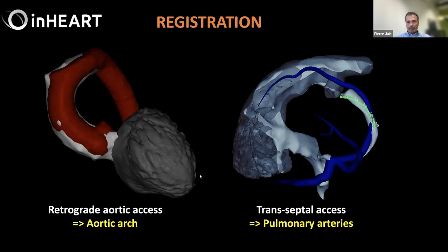If you go transeptal, if you choose to go transeptal, which we often do in elderly with quite some atherosclerosis, you know, there are always plaques in the aorta, and sometimes it's probably safer to go transeptal.